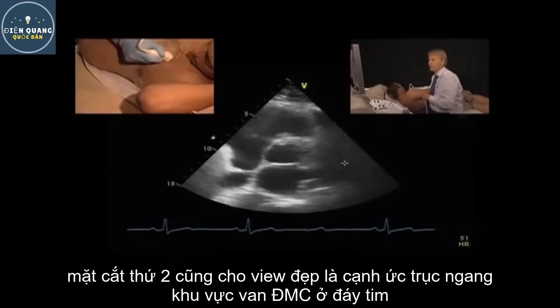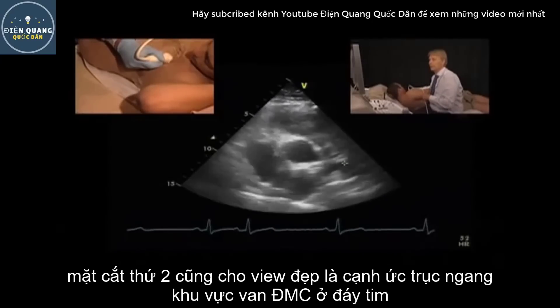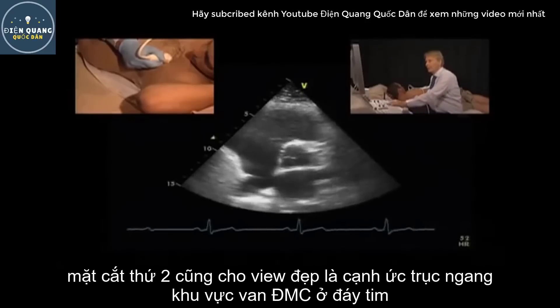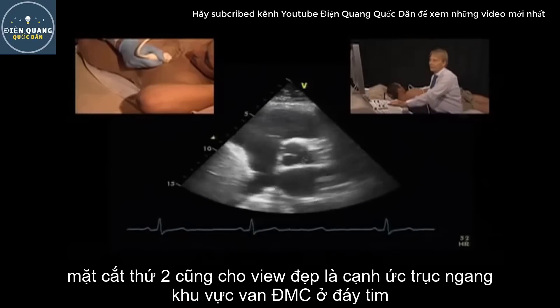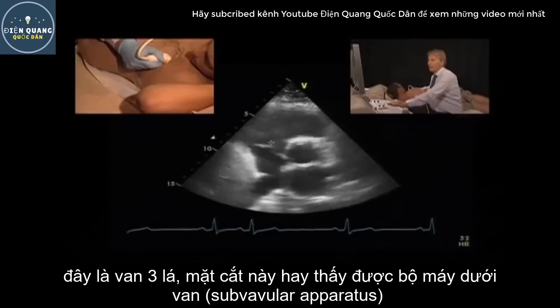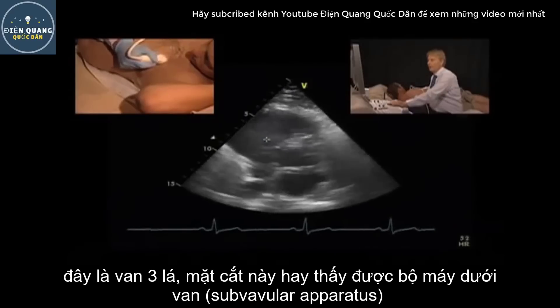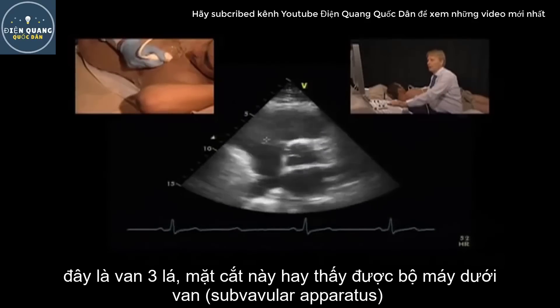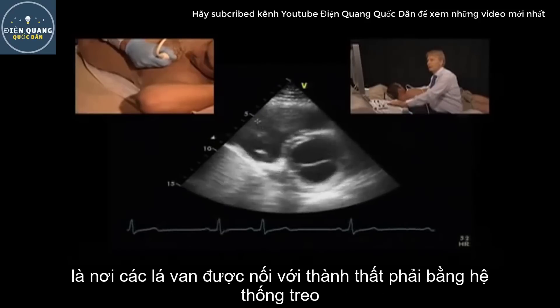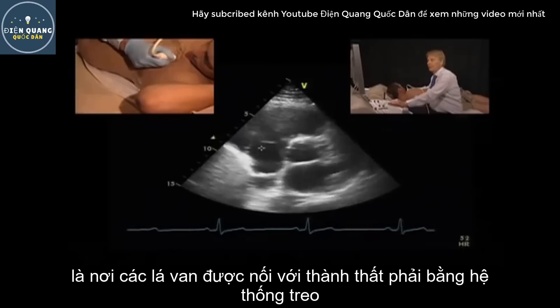The second view, which is also good to use, is the parasternal short axis view. We're somewhere in the region of the aortic valve, so at the base of the heart. Here we have the tricuspid valve, and in this view it is often very nice to see the subvalvular apparatus of the tricuspid valve.